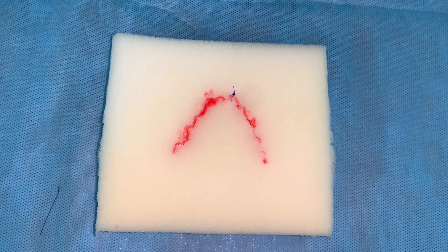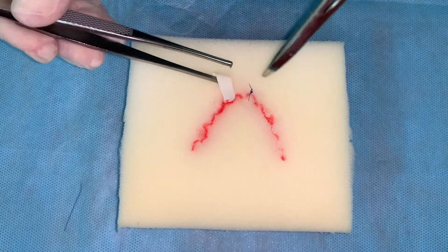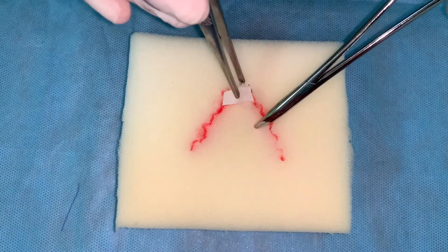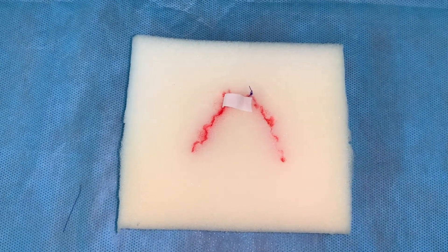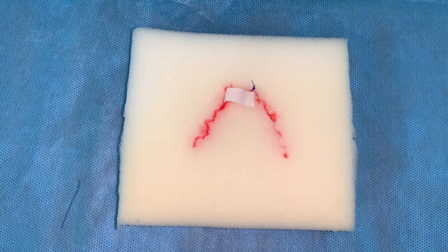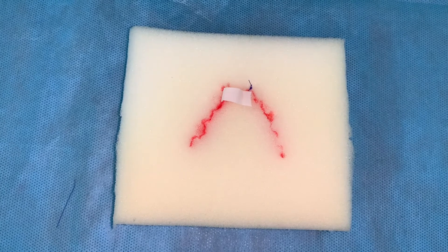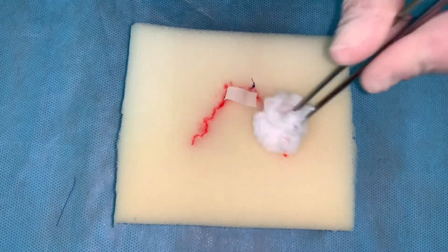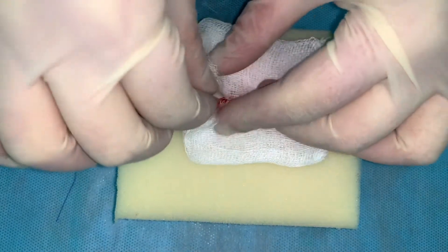Drainage of the bite wound is performed with a rubber drain tube, which is placed into the wound by mosquito-like clamps, and the outer tip is held with the forceps. Antiseptic dressing is applied and fixed with adhesive plaster.